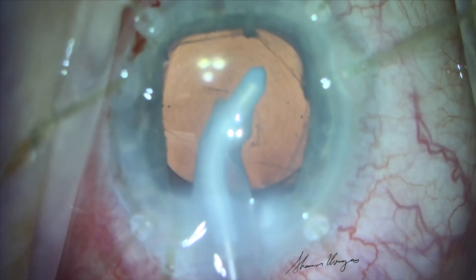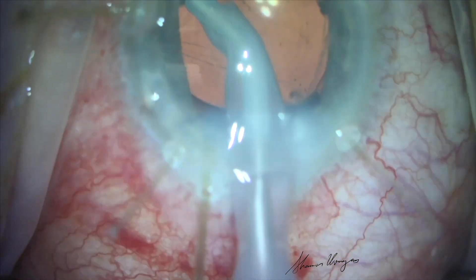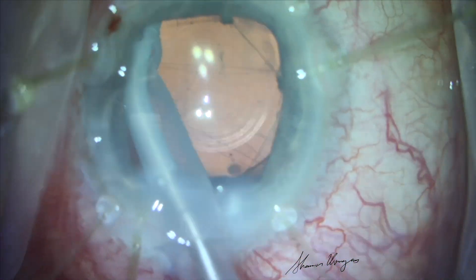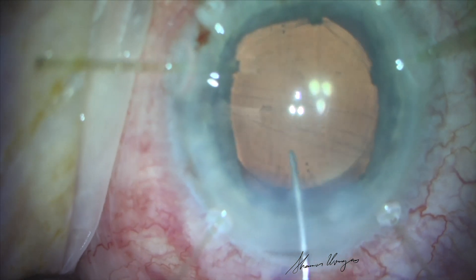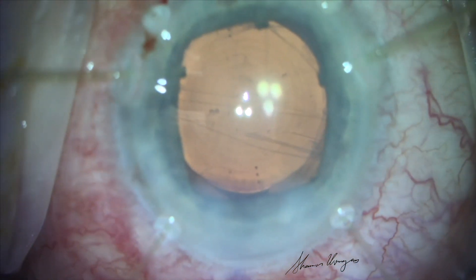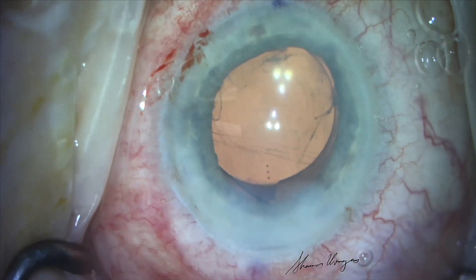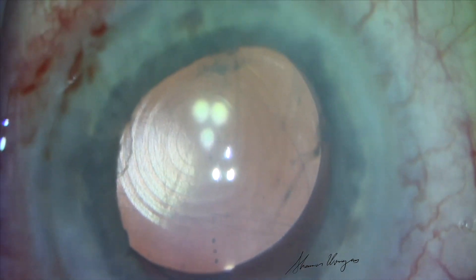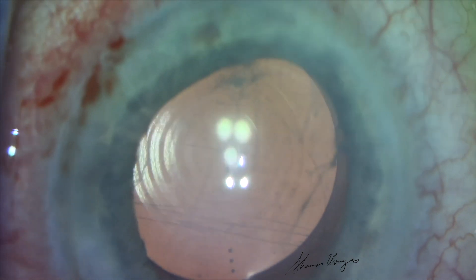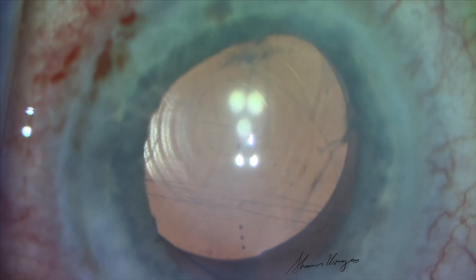When we continue to rotate the lens, we notice striations in the posterior capsule that are not normal. Finally, the lens is in the correct alignment, but there are posterior capsule striations from 3 o'clock to 9 o'clock, despite the IOL being aligned at 12 o'clock and 6 o'clock. Also, the lens is found to be superiorly decentered and anterior vaulted at 6 o'clock.